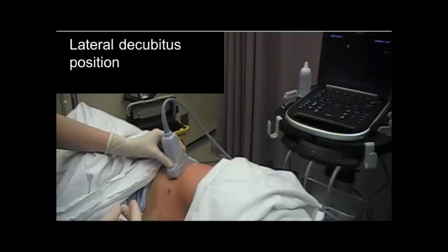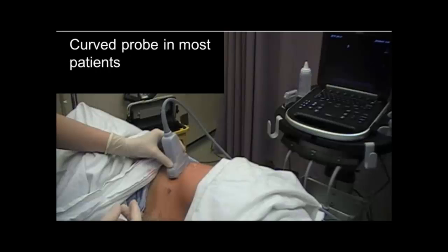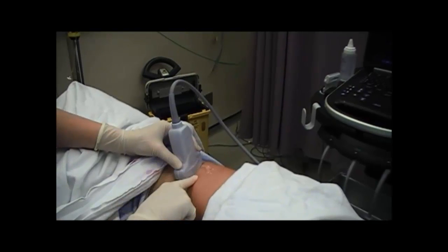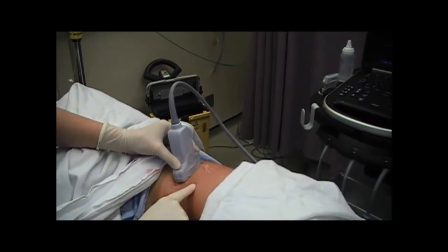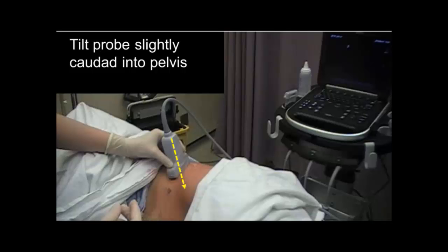It is recommended that the patient be placed in the lateral decubitus position; however, it is also possible to perform the block with the patient in a supine position. The patient is turned towards the operator with the operative side uppermost. The machine is placed on the opposite side of the bed. A curved probe is recommended in most patients unless they are very slim, as the wider field of view and better penetration facilitates recognition of the anatomy. The probe is placed in the mid-axillary line just above the iliac crest. The external oblique, internal oblique, and transversus abdominis are identified and traced posteriorly to where the transversus abdominis tapers off into its aponeurosis. The quadratus lumborum is often, but not always, visible just posterior to this taper. Tilting the probe slightly caudad into the pelvis often improves the view of the tapered end of transversus abdominis.